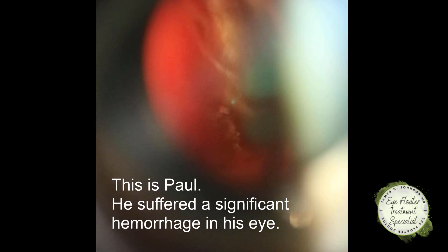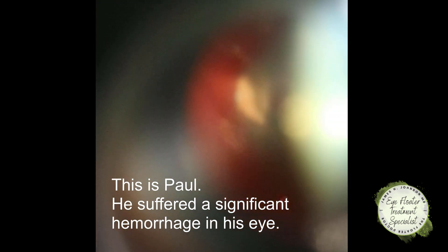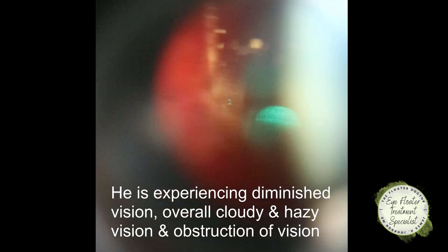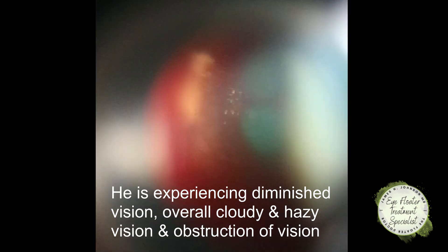Look down for a moment and then back to the light - there we go. I'm going to see if I can break some of this up and help accelerate the dispersion of this stuff, give some immediate relief and maybe break away some of the red blood cells from their sticky protein aggregations and help get them to filter out of the eye the way they normally would.